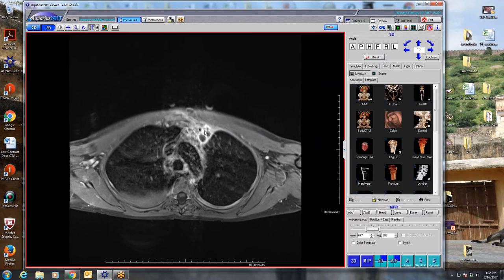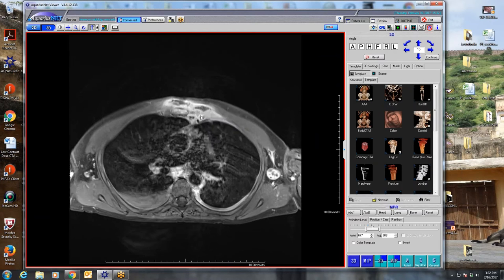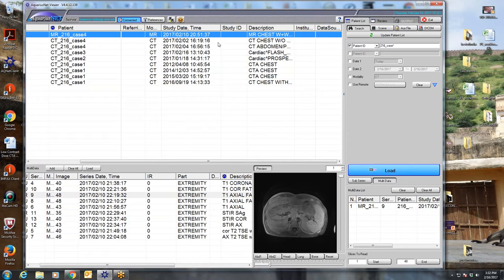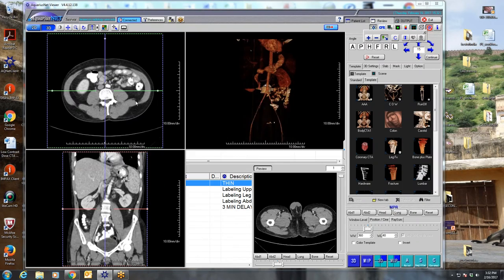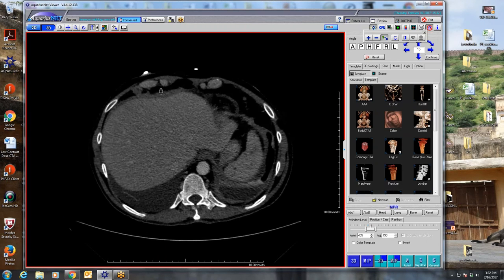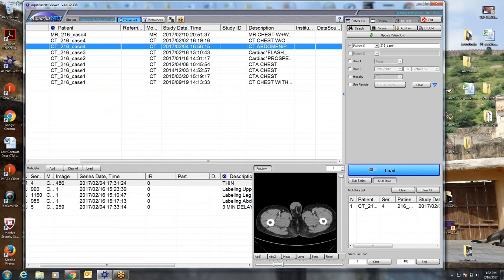This is a case of tuberculosis with empyema necessitans, which I haven't seen since I was a resident in Colorado. This was an MSK MRI — that's why the images look so ugly — to look at the osteo findings. You could see this extending through all these enhancing lymph nodes. They got a belly CT as well, which shows the findings you'd expect — splenic lesions from TB and other abdominal findings. A case of disseminated TB with empyema necessitans, which I haven't seen in a long time. Brent probably sees more of that at Grady.